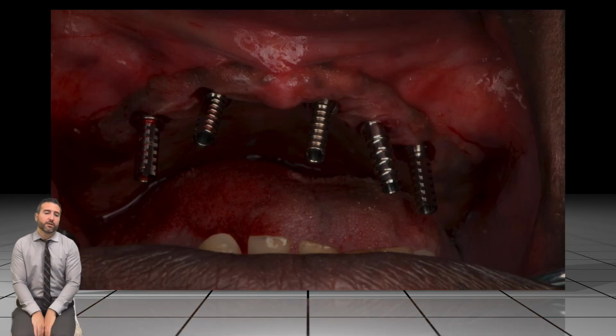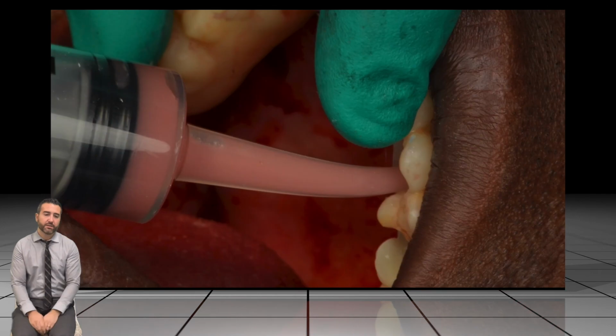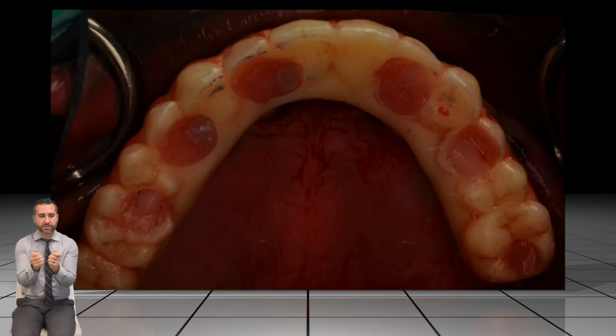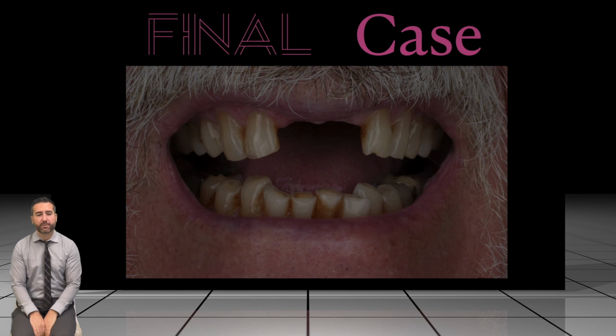And so here we are. We're just on the day of surgery picking up the temporary multi-unit cylinders here, and we have our holes pre-cut. We inject, in this case I like to inject good old PMMA into the area to lock onto those temp cylinders. Then you unscrew the whole thing, cut that palatal stop off and polish, and then screw it all back in. So, you know, this was all pre-surgical. Here he is with his finals. Very happy man. Everything was super successful in this case with that 3D printed hybrid prosthetic.